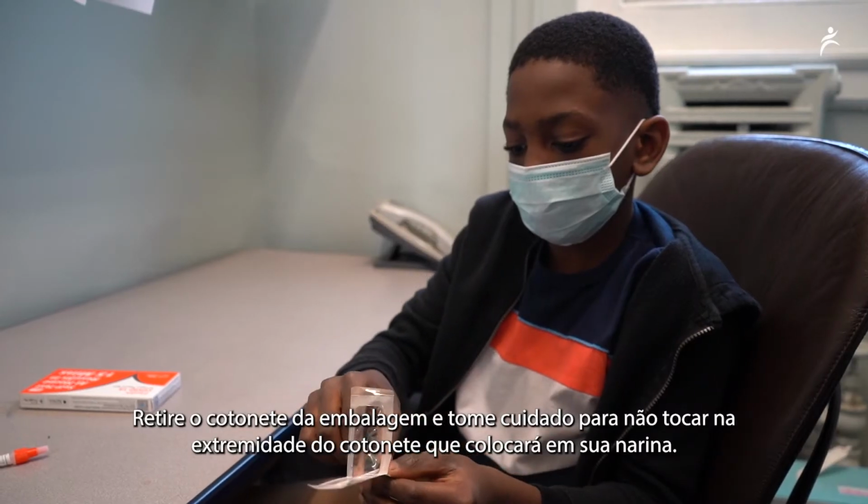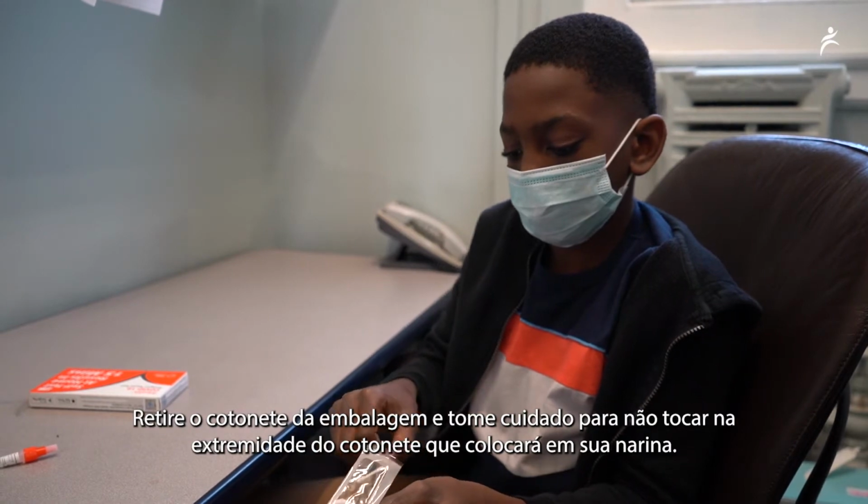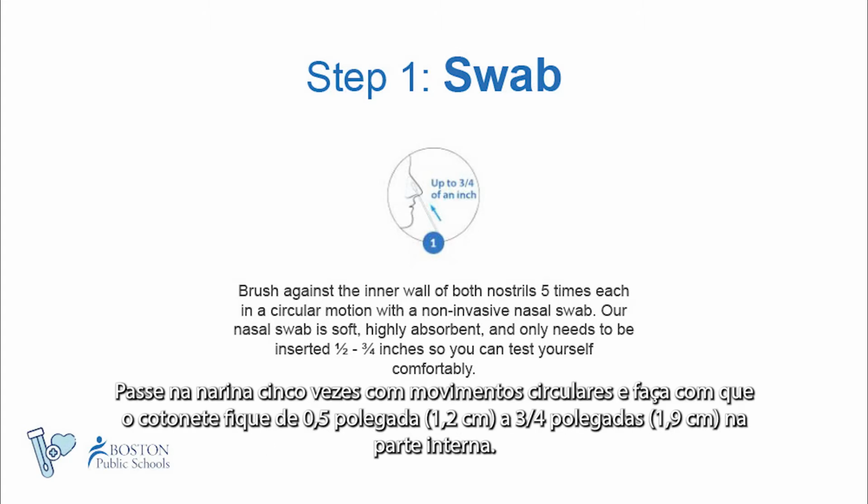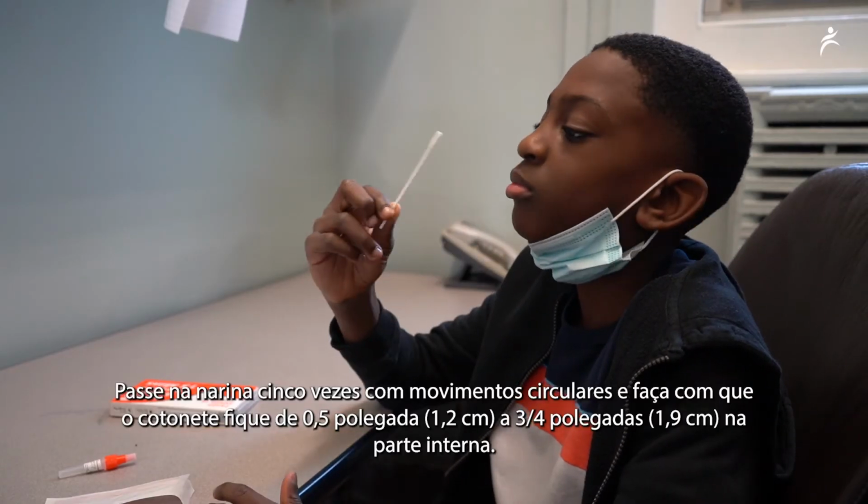Remove the swab from its packaging and be sure to not touch the end of the swab that you will place in your nostril. If your test tube does not already have solution in it, carefully squeeze the solution into the tube. Brush against the inner nostril 5 times each in a circular motion and have the swab be about 1/2 inch to 3/4 inch in.